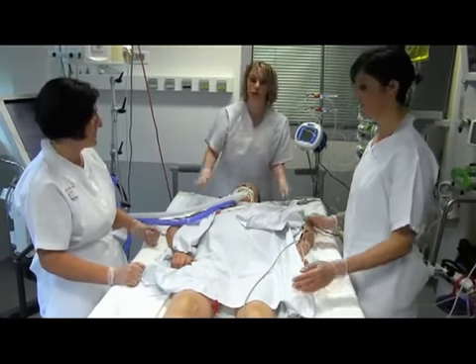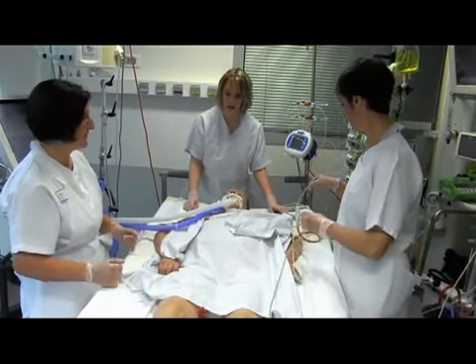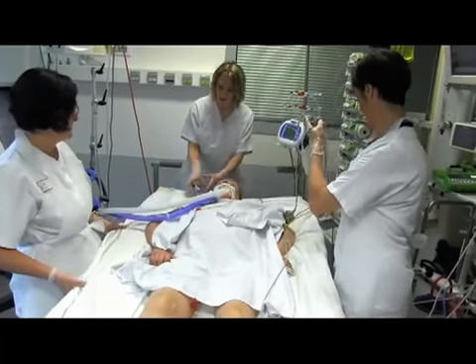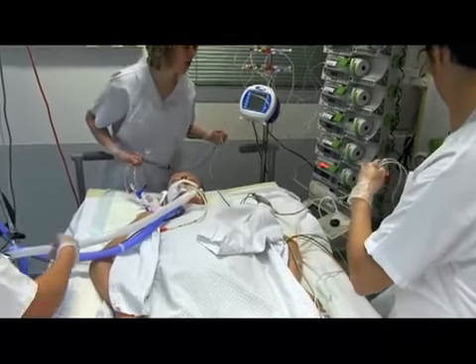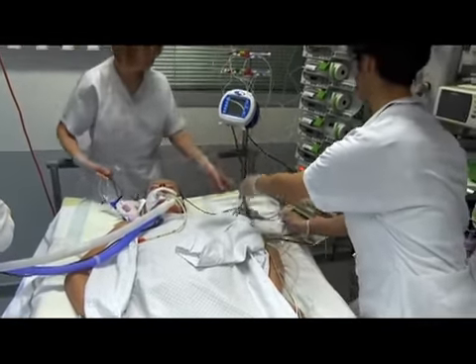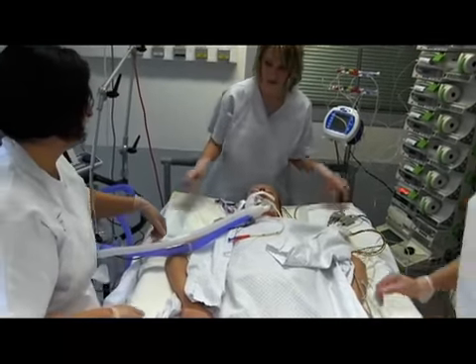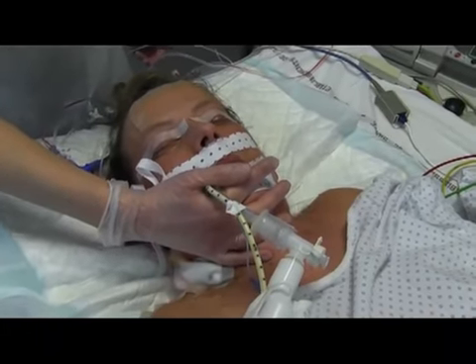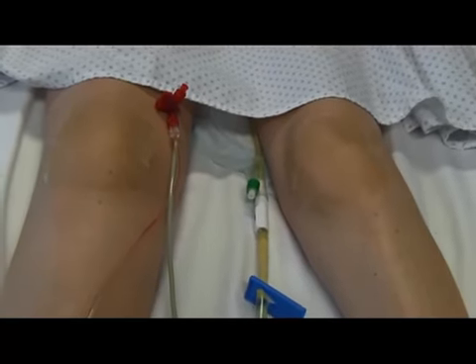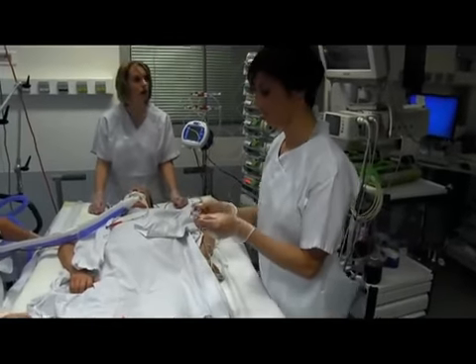The first step is to prepare the procedure. At this stage, you have to decide which direction to turn the patient, to the left or to the right. Priority is given to whichever side the central venous lines are located. Check the length of the vascular lines and the transcutaneous saturation cable to be sure they are long enough. Move the ventilator as close to the patient as possible. Check the patient's hemodynamic status and the level of sedation. Secure the endotracheal tube and the gastric tube. Protect the skin on the forehead, knees, iliac crests, and thorax from pressure sores using adhesive pads.